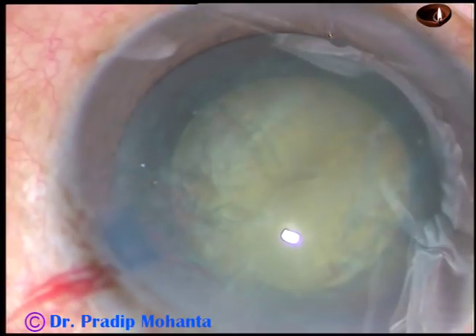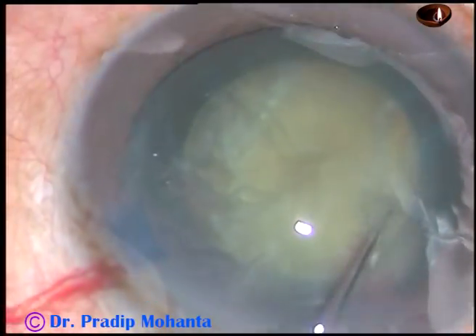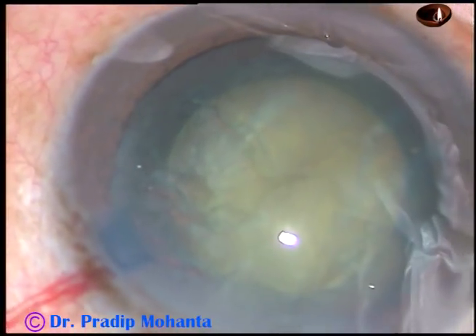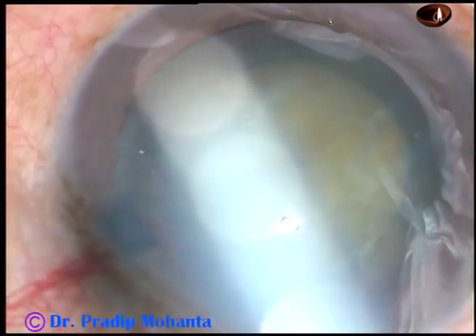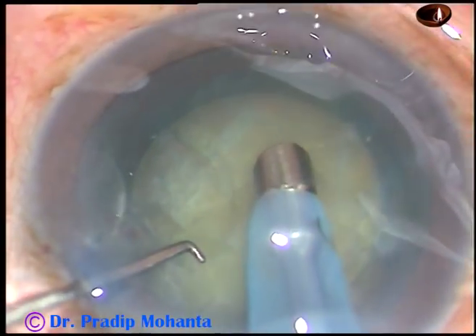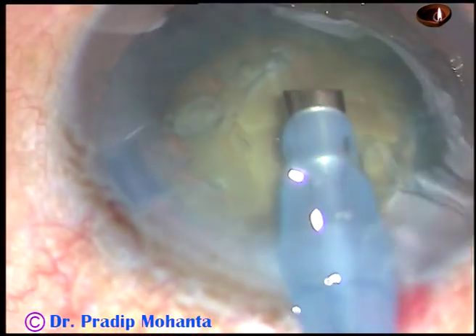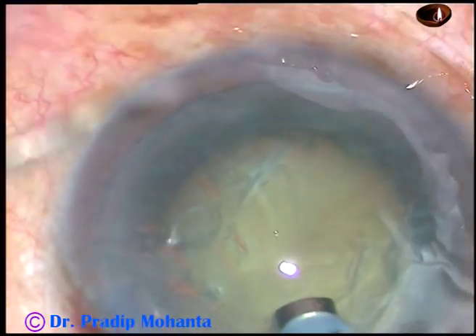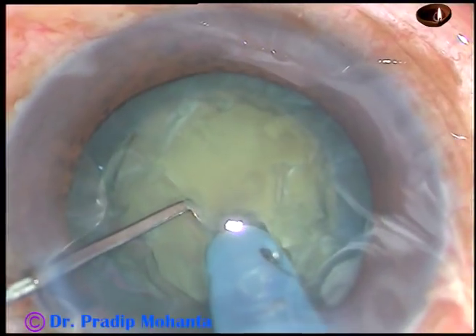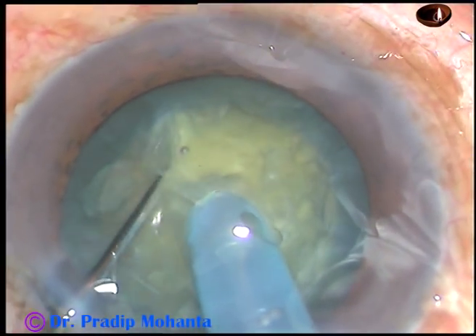So what to do now? The technique that I have learned from a person whom I respect very much — Dr. Narayan Bhardalui, who is founder of Chandraprabha Eye Hospital at Jorhat, Assam — I was with him for a couple of days and learned this technique. No hydro FACO — he also calls it pure FACO. Just bury the tip into the substance of the nucleus and make a very good groove through and through.